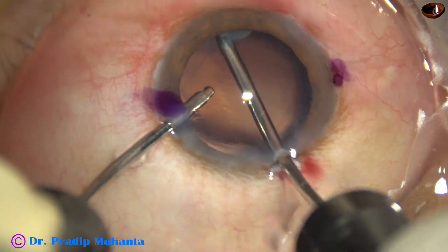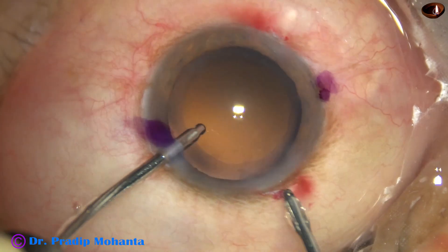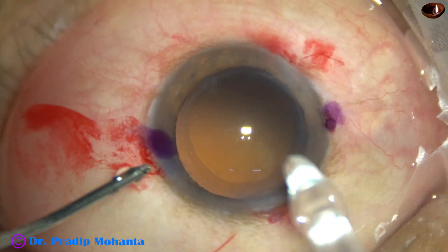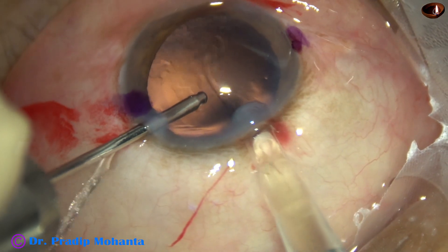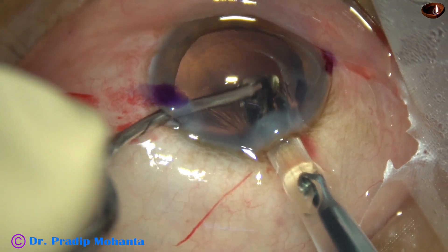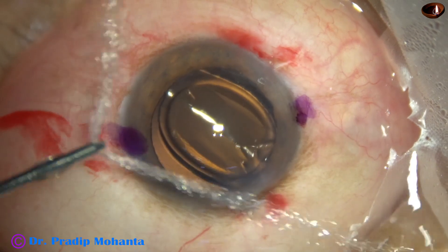The toric IOL has to be placed at 170 degrees. I want to implant the toric IOL without using visco, so here is hydro-implantation of the toric intraocular lens. The left hand instrument is guarding the lens so that it does not tumble or shoot.